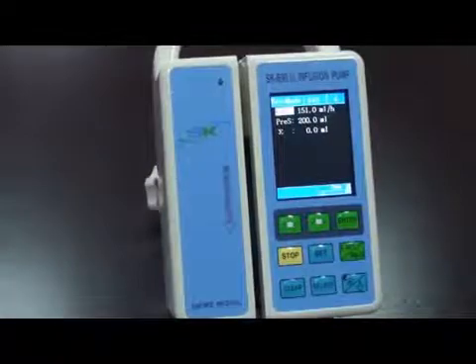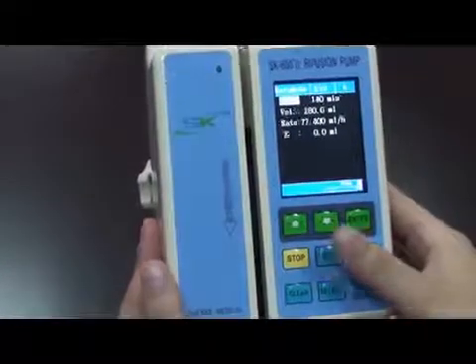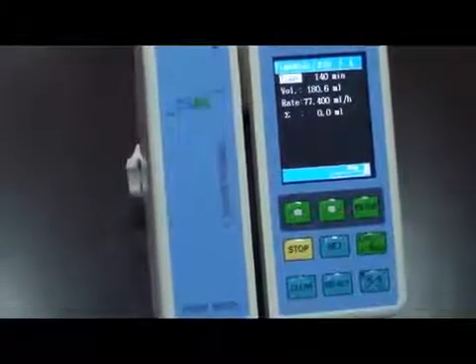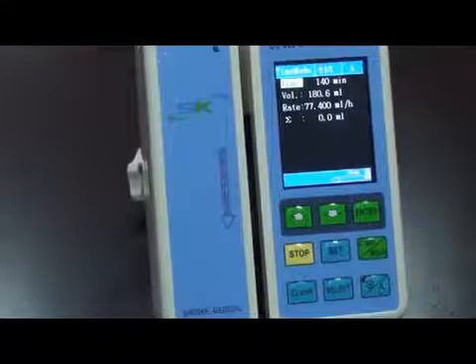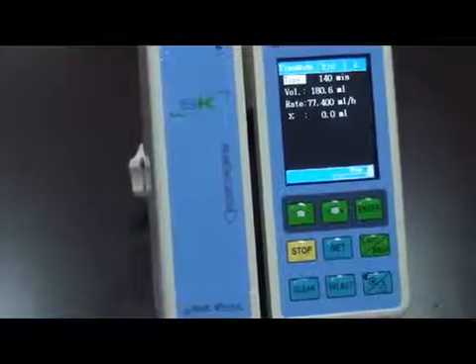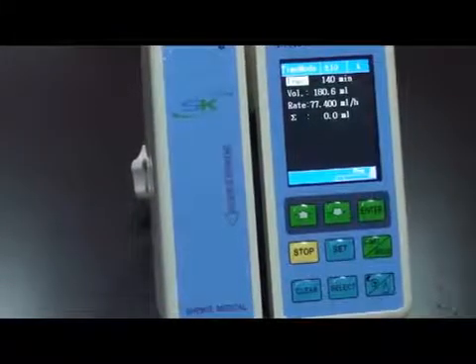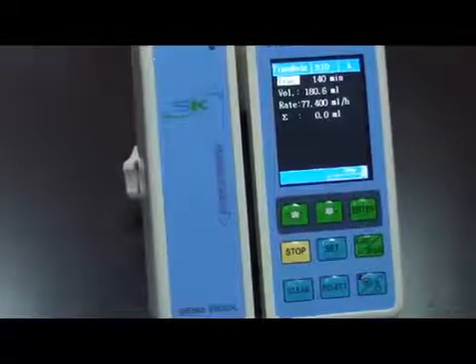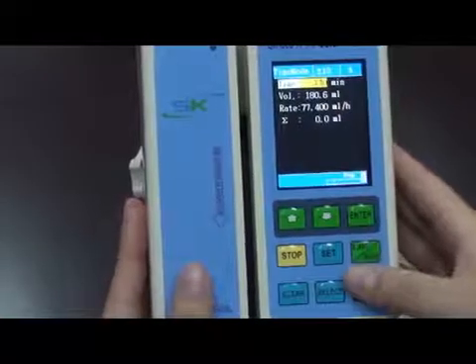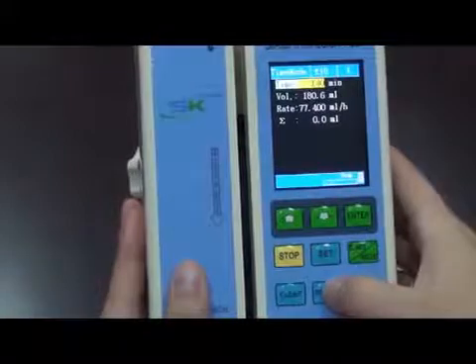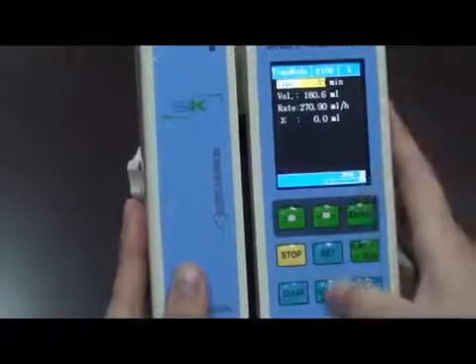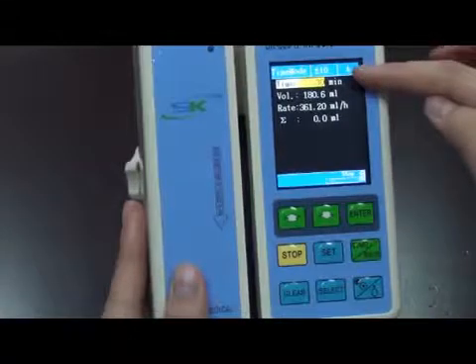Now let's come to time mode. Press the set key once — this is time mode. For example, a nurse wants to give a patient an infusion for 30 minutes and the total volume is 60ml. She could set the parameters in this way: firstly, choose time, and change it to be 30 minutes. This is 30 minutes.